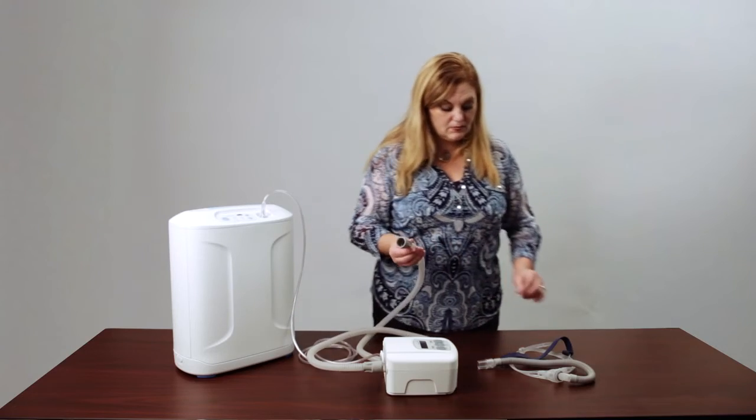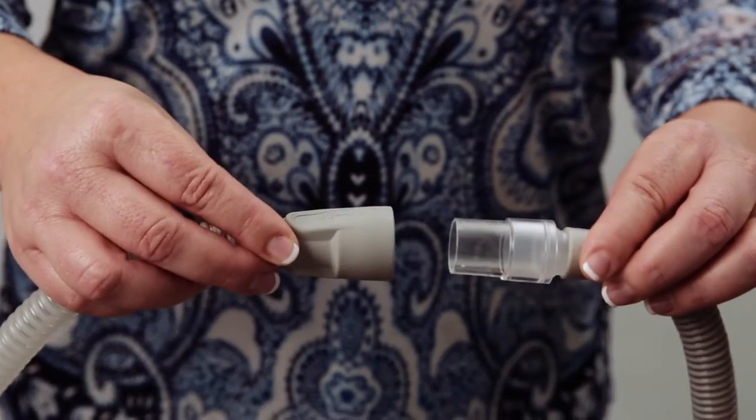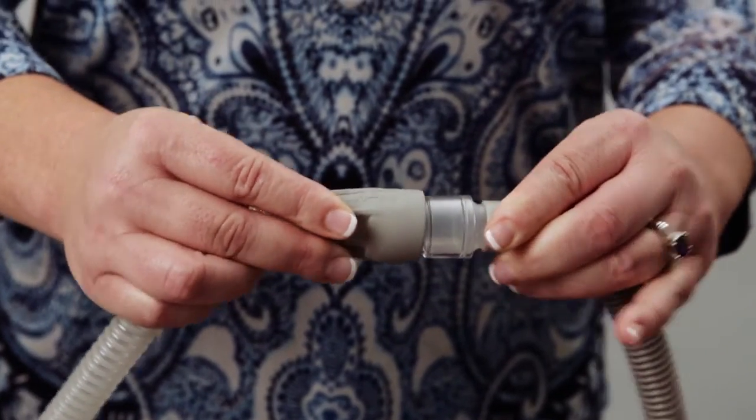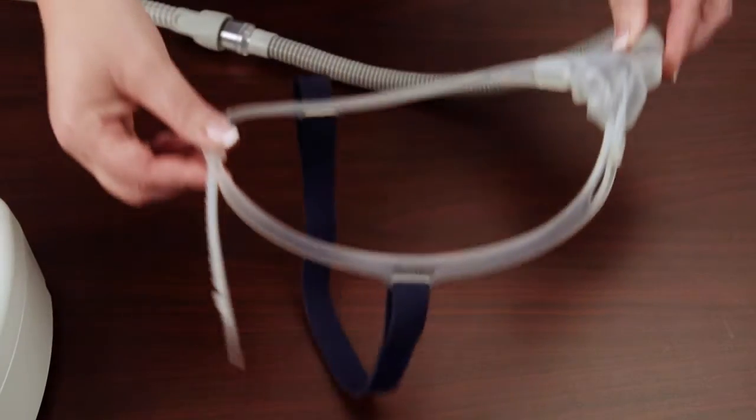Connect the other end of the CPAP tubing to the mask. The oxygen will flow in through the adapter along with the air pressure from the CPAP machine.